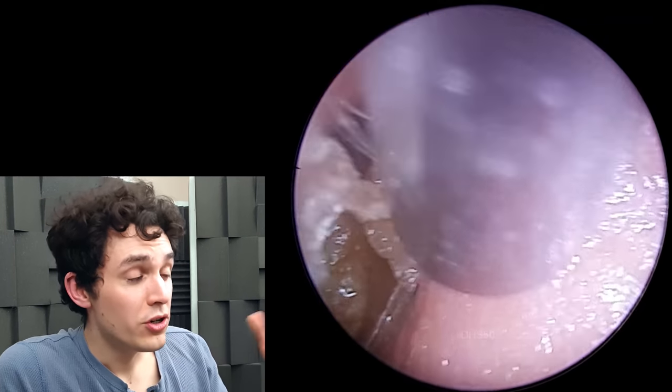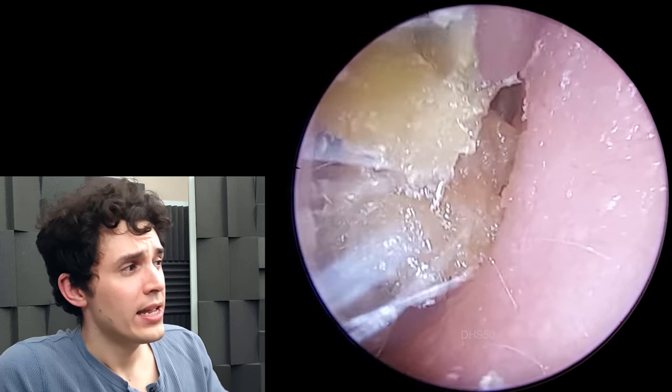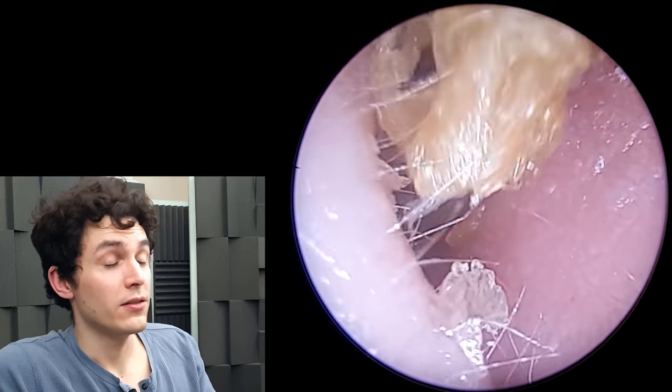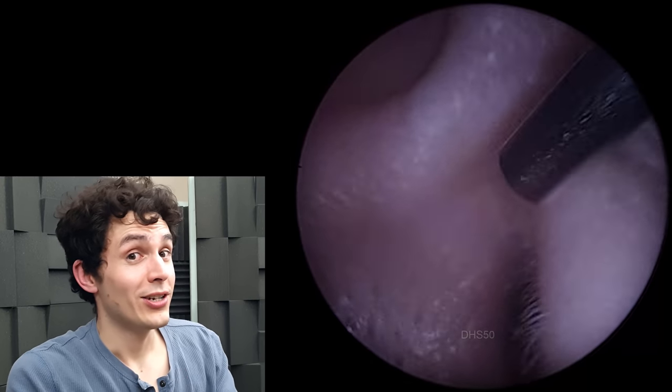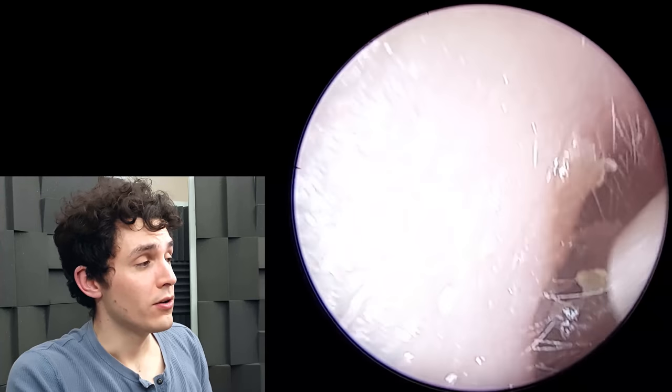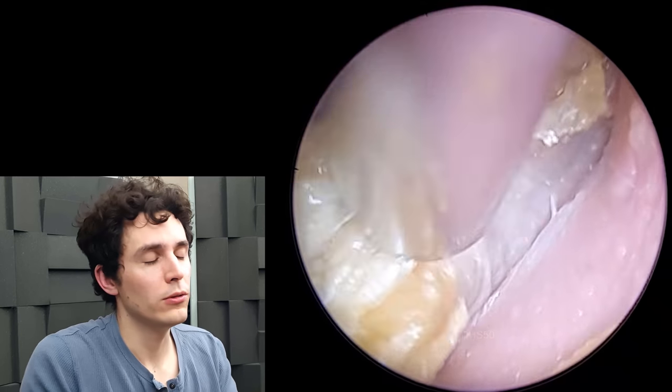Initially I go in with the suction, remove all the dead skin and everything that's in the way, and then I try to move this boulder essentially. But it's actually too large to get out of the ear canal. So the aperture of the ear canal — the entrance to the ear canal — is actually slightly smaller than this earwax boulder.